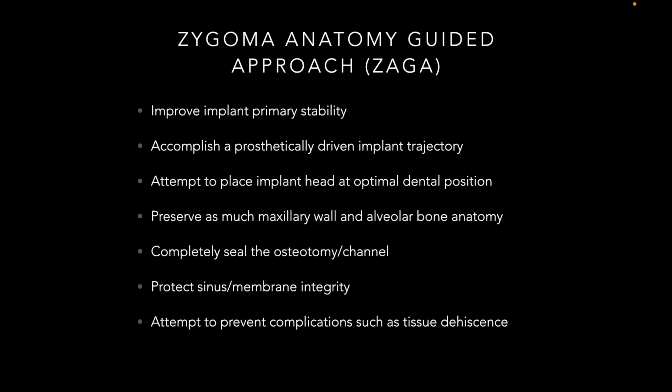Okay, for this section, we're going to classify the different zygomatic structures, and this is really important to have because, not only from a CT scan or clinically, you can determine whether you're going to do a channel osteotomy, you're going to do the slot technique, or whatever the case might be.